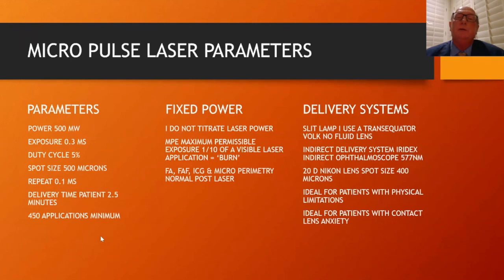and one learns as the hair disappears and the hair becomes gray that there is no one fixed answer. So someone like Dr. Calzada, who's extremely careful and is looking after the numbers, I think that's as good as anything that can be done. This is very simple for those that are getting started. You don't have to worry, am I doing enough? Do I do 50%? How gray is a gray burn, et cetera? Those are things that can be problems.